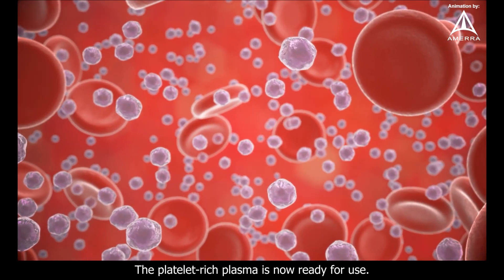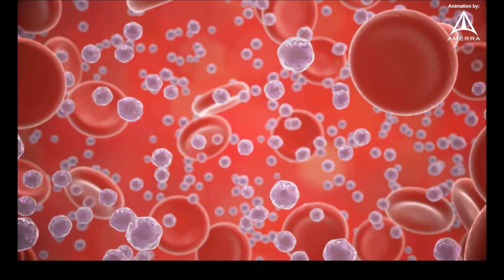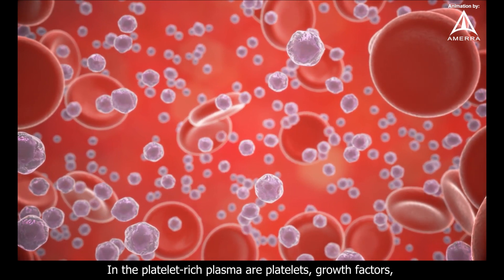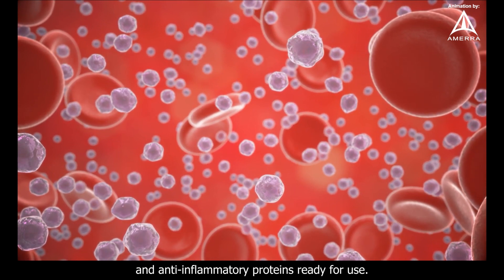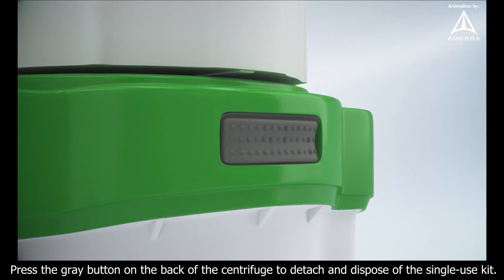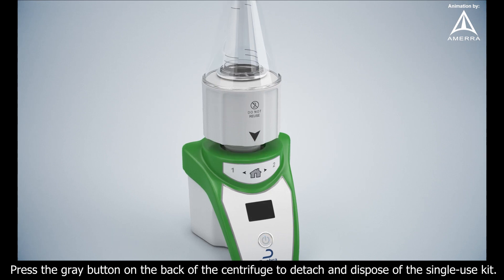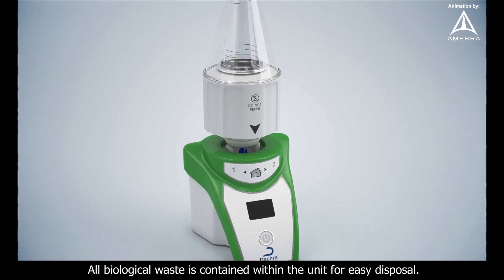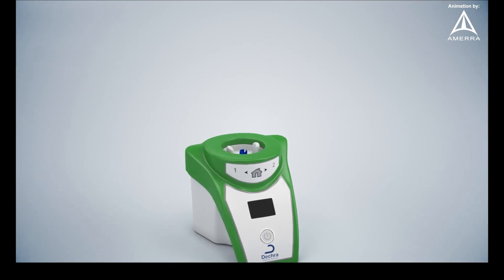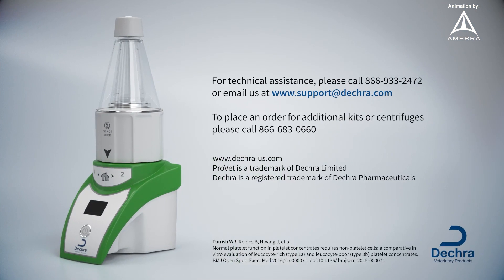The platelet-rich plasma is now ready for use. In the platelet-rich plasma are platelets, growth factors, and anti-inflammatory proteins ready for use. Press the gray button on the back of the centrifuge to detach and dispose of the single-use kit. All biological waste is contained within the unit for easy disposal.